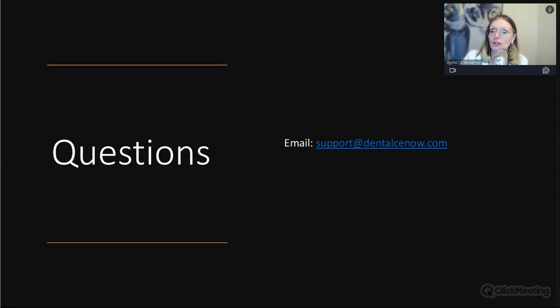Thanks for that question, Carla. Question from Donna: how long of an exposure to UVC light is effective? No ozone should ever be inhaled into the lungs. Poor outcome. It depends on the device itself, and we're going to have Danny break that down for you. Again, that goes for any light-emitting device. It has to do with power as well as time.